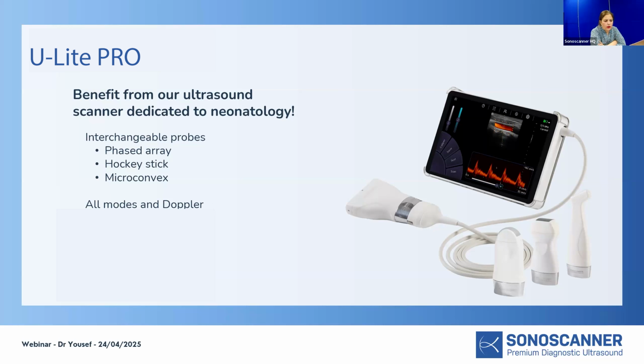So I would not use only the lung ultrasound score for switching. That would definitely be clinical judgment, multifactorial, and where the added value of the lung ultrasound score comes in is to be able to individualize this, be it surfactant, ventilator care, BPD babies, or PDA. It is really not a one-size-fits-all, being able to see what this specific baby needs at this specific time, and being able to use this added information about lung aeration to guide management.